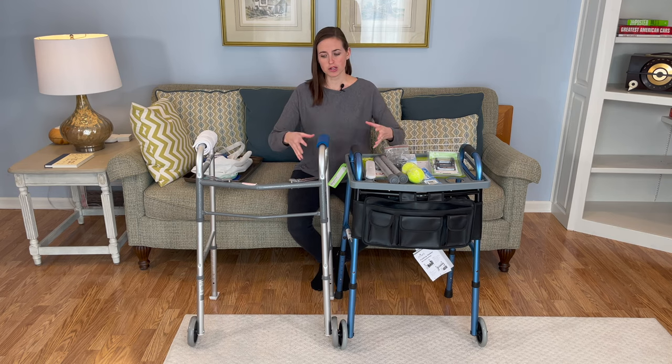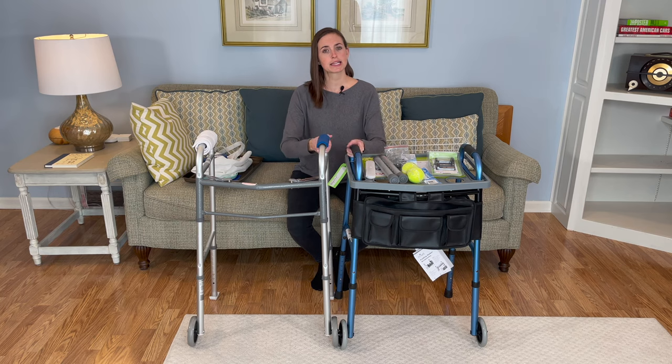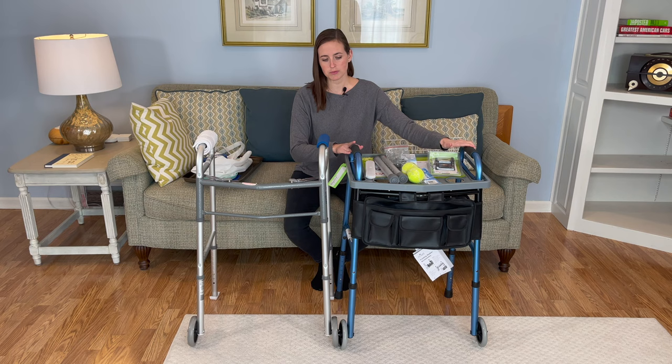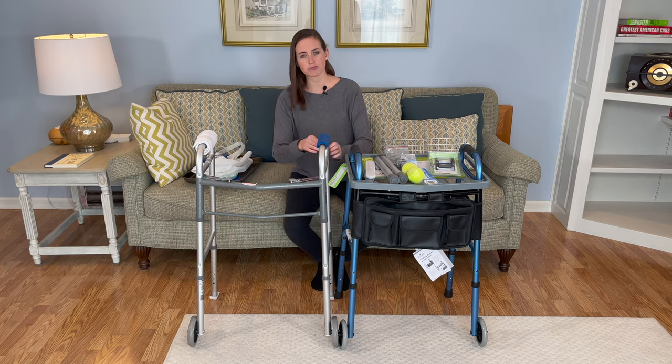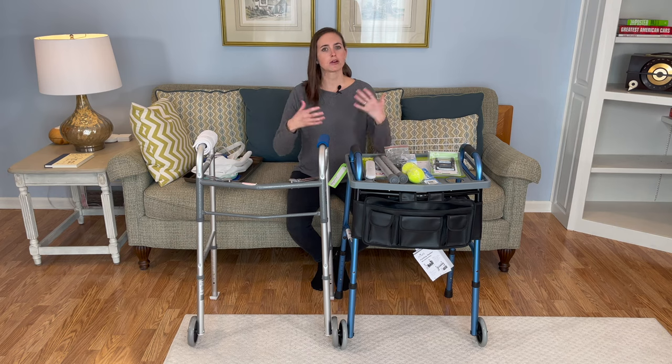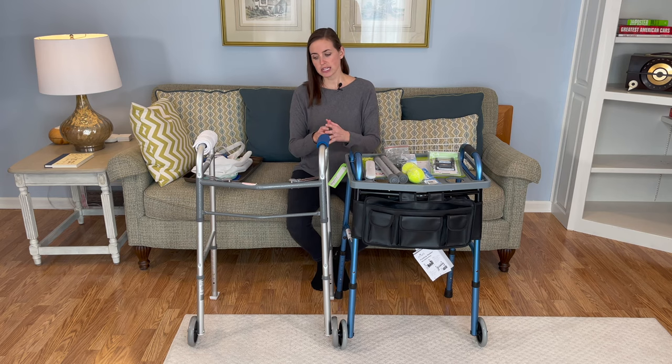The walkers I'm going to be going over today are your standard walkers. This one I have here by Nova comes in a fancy blue, but they all typically come in this silver model, which is by Guardian. There's also Drive Medical and several other varieties, but they're all roughly similar as far as their construction and the way you use them. Today specifically, I want to go over the various parts of the walker and how they can be accessorized to be more practical for your needs.